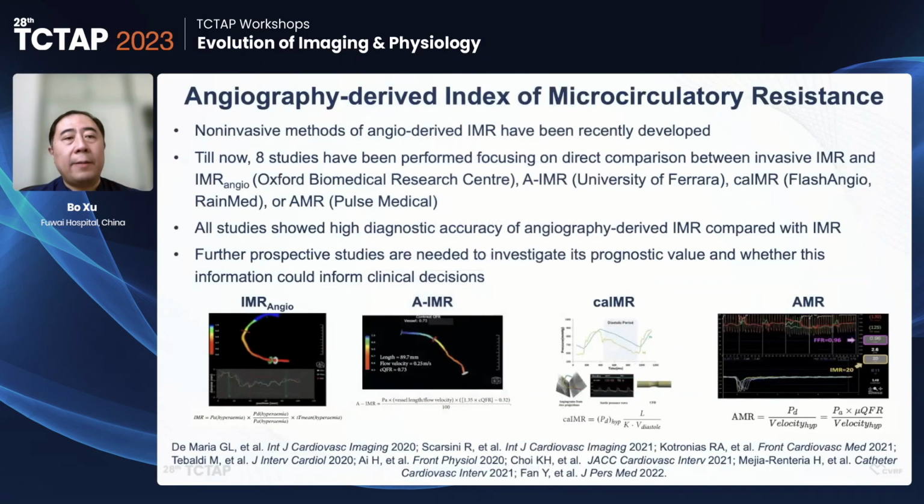What about the angiography-derived index of microcirculatory resistance? Until now, studies have been performed focusing on direct comparison between invasive IMR and angiography-derived IMR.